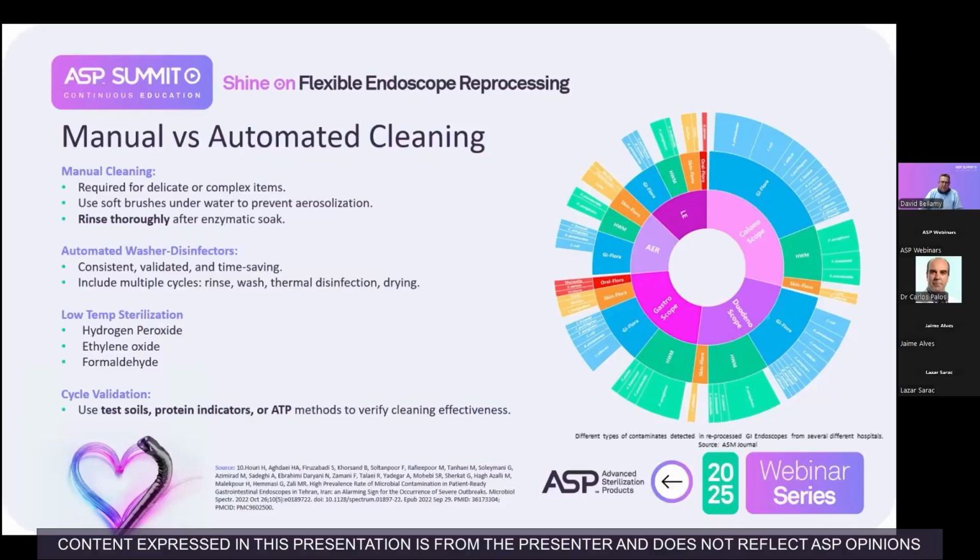There are still many discussions about the manual step process. There is talk about that being automated, and I still feel that manual is a better option, but as technology advances, we will get more automation happening there. But all the standards agree that it must occur prior to high-level disinfection reprocessing and must be performed by trained personnel under controlled conditions.